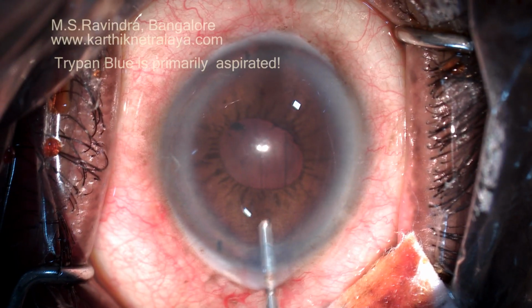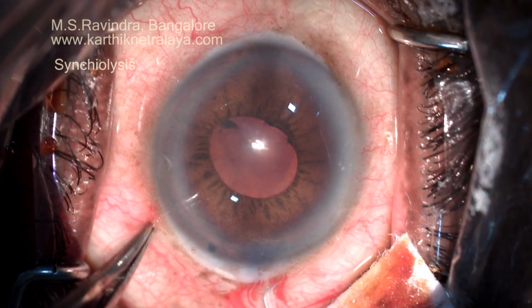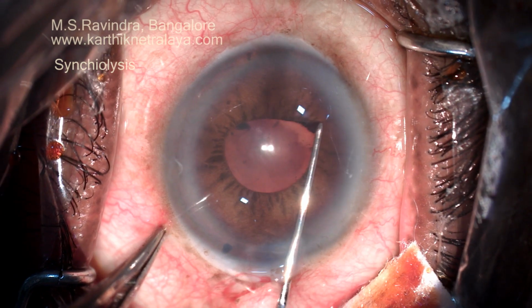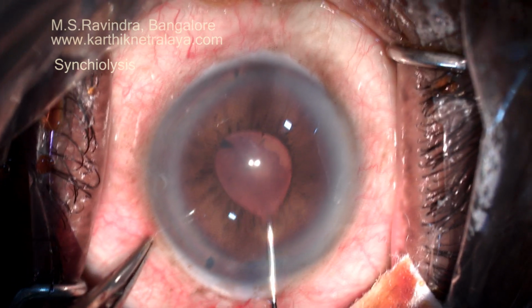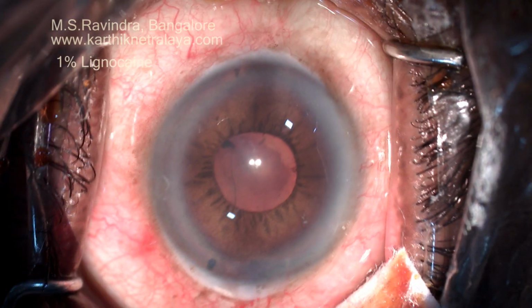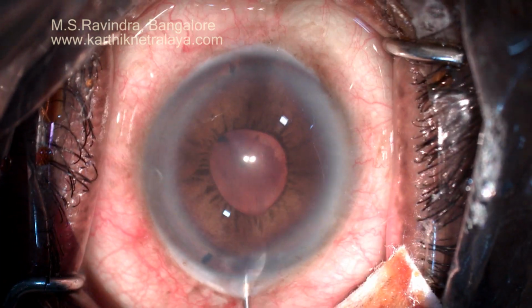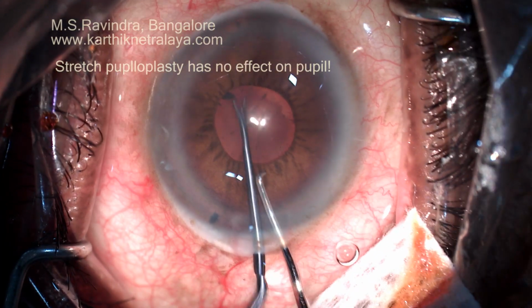There were posterior synechiae in the upper nasal quadrant. Anterior capsule was stained with trypan blue. The posterior synechiae was released. The pupil is rigid. Intracameral 1% lignocaine is infused.